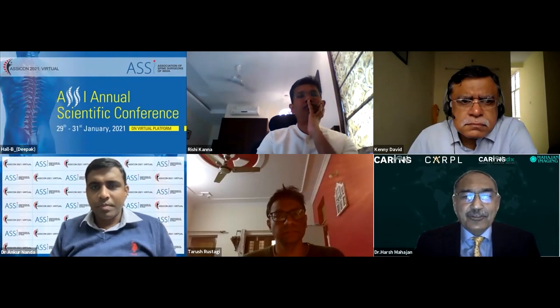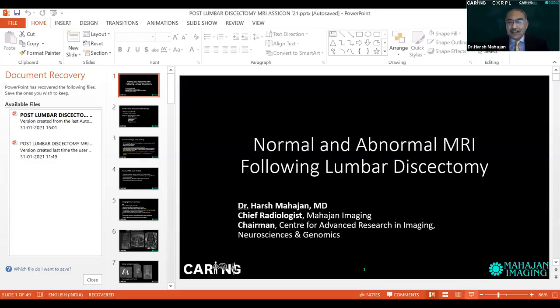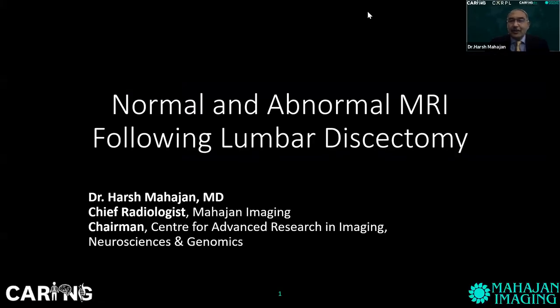Thank you so very much for this honor. And I take you straight to my slides. I'll be talking on normal and abnormal MRI following lumbar disc surgery.